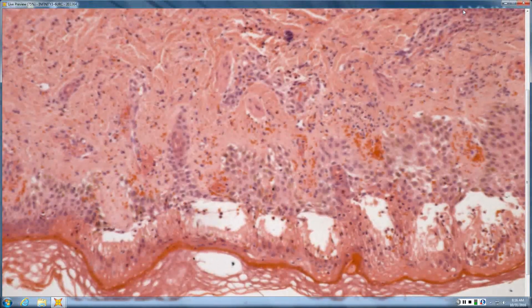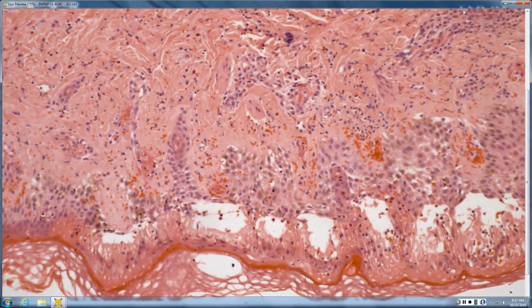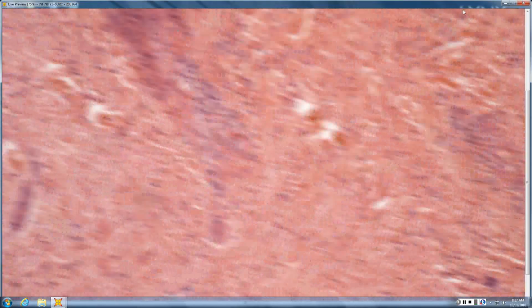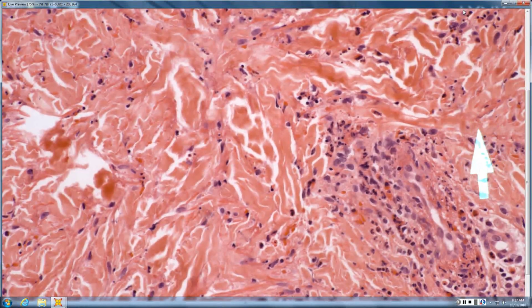But sometimes it's just that the vasculitis was bad enough that it necrosed the epidermis. So you've got that differential to keep in your mind. And then when you look at the vessels, it looks like there's a lot of karyorrhexis, sorry. Yeah, so we have ant heads. We have decapitated ants, right? They look intact, so it looks more like LCV.